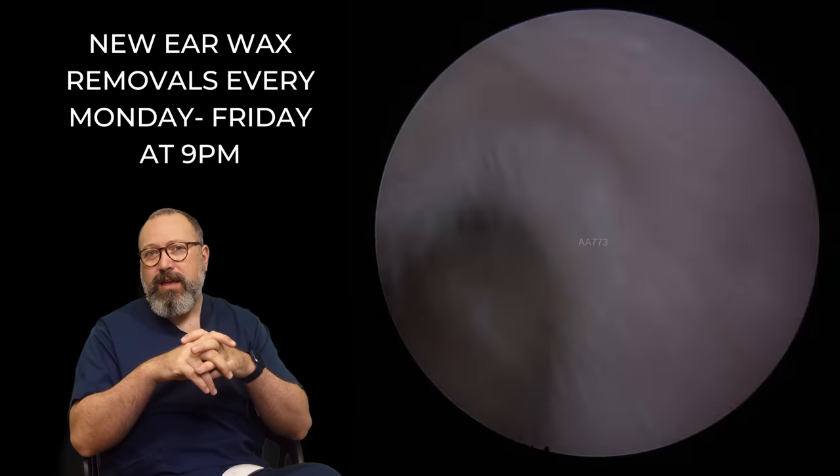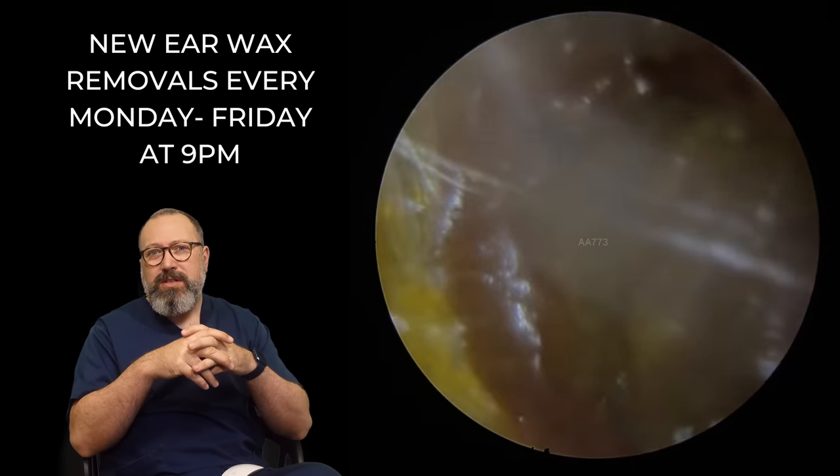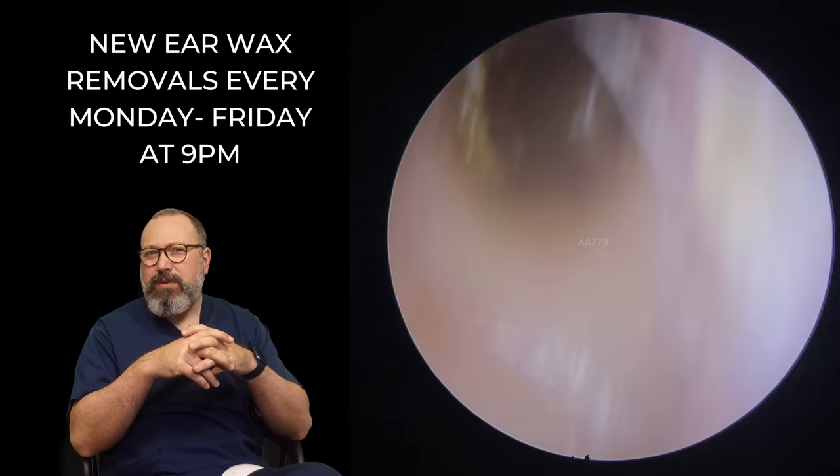You can see it's cleared away really, really well — you can see the eardrum beyond it there. So this is actually the second patient in the compilation, I think.